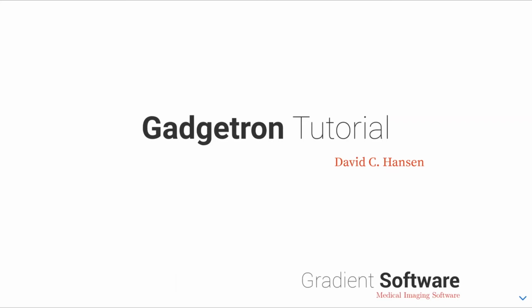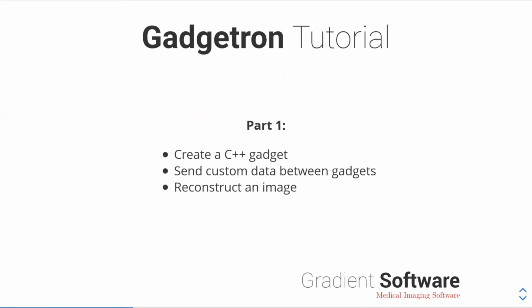Today, I will be talking about how to write a C++ gadget. For the first part, we're just gonna create a simple C++ gadget that's going to accumulate a bunch of acquisitions together in a k-space buffer. We will send a custom data type from this gadget to the next gadget, which will reconstruct an image. So it will be very basic on the MRI side, so we can focus on the C++. That will be a live coding exercise.